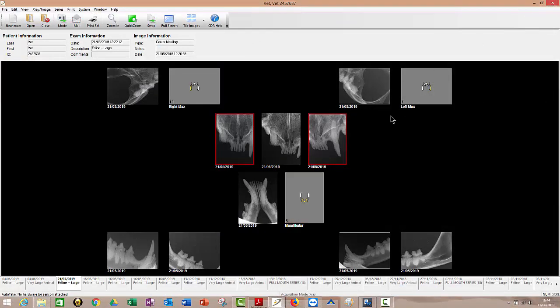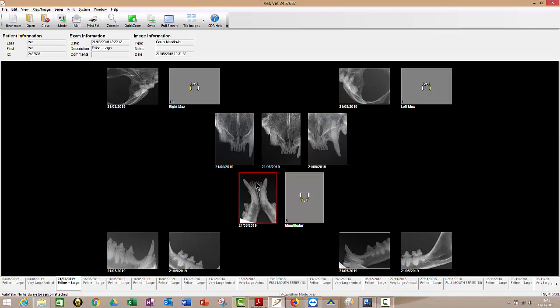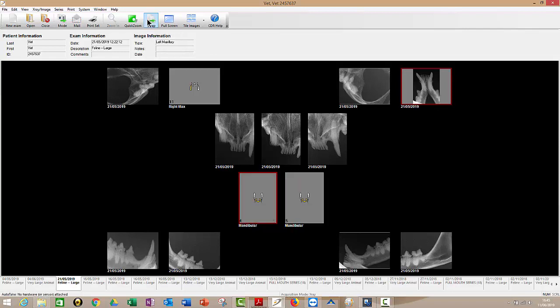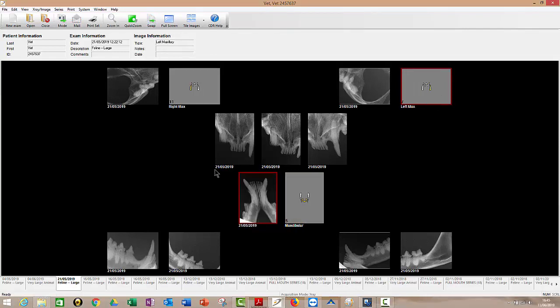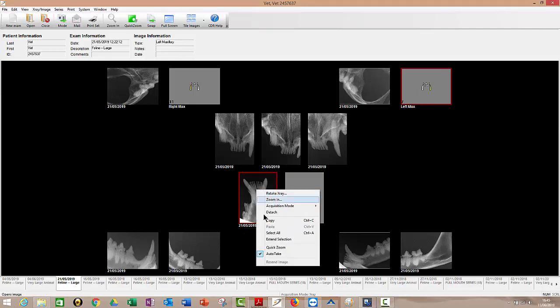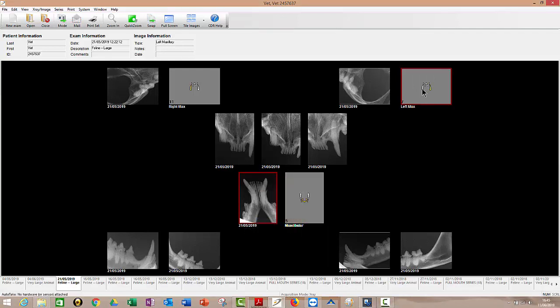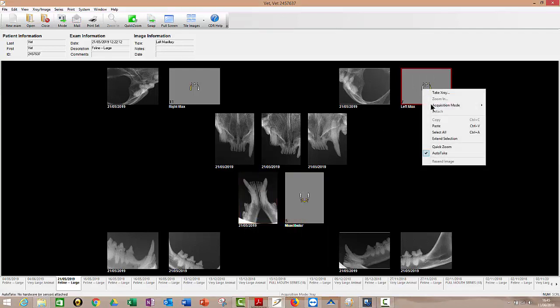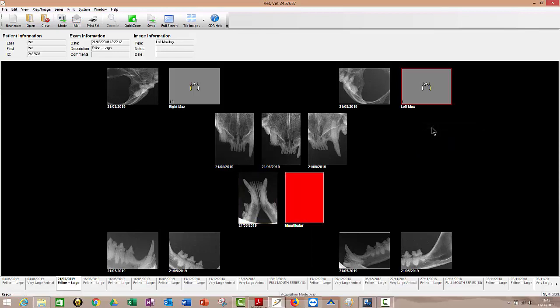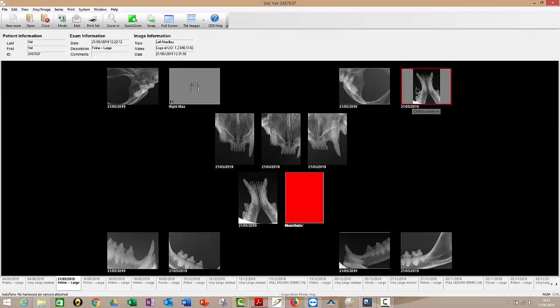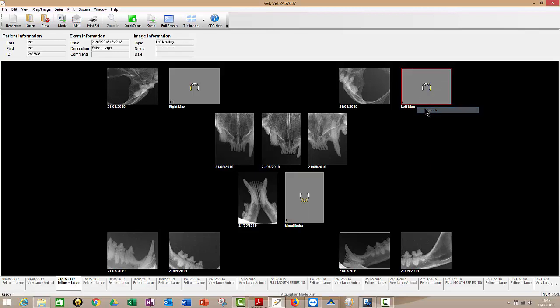And also if you happen to have forgotten and put the wrong image in the wrong box. So say that one, which is obviously in the right place, but say it should have been up there. Again, just hold down control and then you can swap them. Put it where it should have been. Swap them back if you want to. You can also right click, copy, right click, paste. So it'll be there. You can paste into a Word document as well if you wanted to, if you're writing letters. If I right click now, I can detach that so it's gone. It hasn't actually deleted it, it's just detached it. So we could always get them back if necessary.